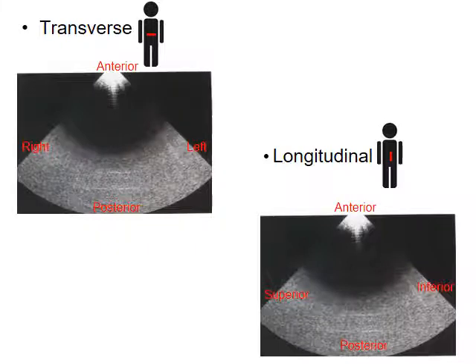Now, as I said, this is just stock standard routine. All sonographers do this everywhere. And it allows us to look at ultrasound images that anyone's taken from anywhere and have this same orientation. So when you start scanning, every time I pick up a transducer for a new patient to start, I work out the dominant side of the transducer.